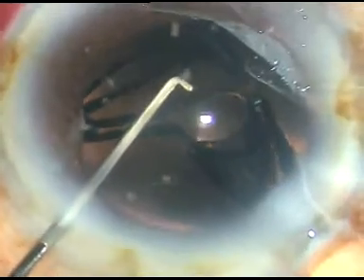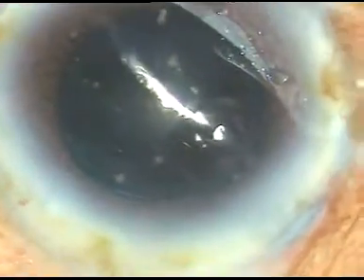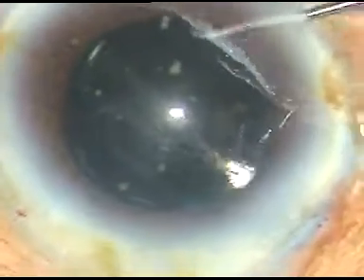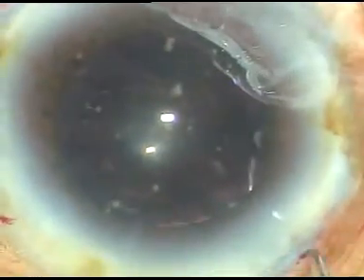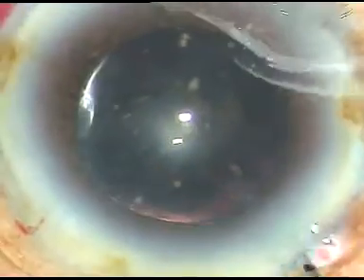The chopper supports the optic. Now I take a Sinski and rotate this lens so that I can go behind the lens and clean the viscoelastic substance which is in the capsular bag.